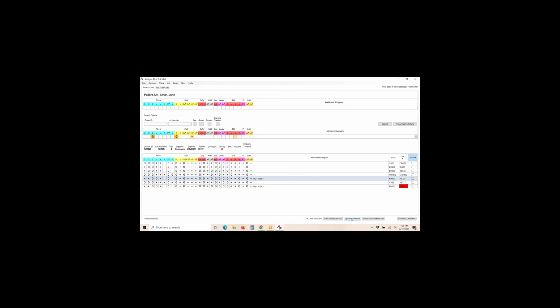And now once we're done selecting cells that we want to pick, let me uncheck this real quick. In this array, the dark orange means those are things that have not been excluded in your panel that you've already entered results on. So we have E, K, JSA, and M. So M turned a lighter shade of orange, because if that cell that you picked in the previous search is negative, now M will be excluded.